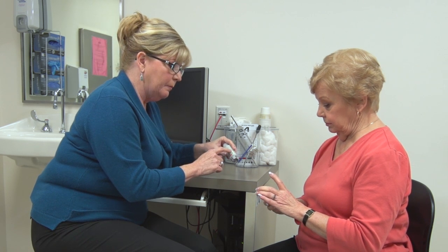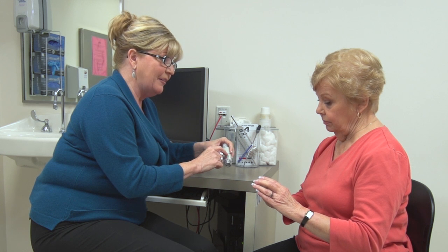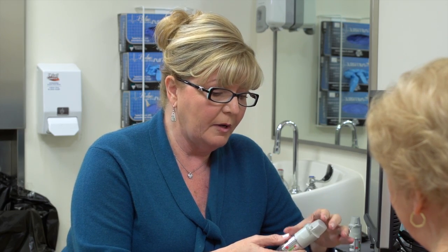On the side of the label is a dose indicator showing green and red zones. As long as the pointer is in the green, the patient has up to 30 doses remaining. Once the pointer moves into the red, there are about seven days of medication left, and the patient should get a refill. When the pointer reaches the bottom of the red, there are no doses left — the inhaler device locks and should be discarded.